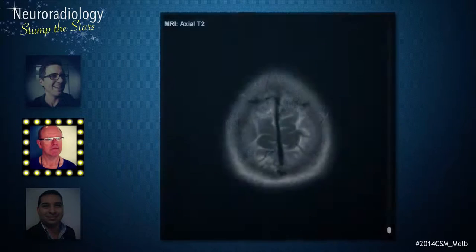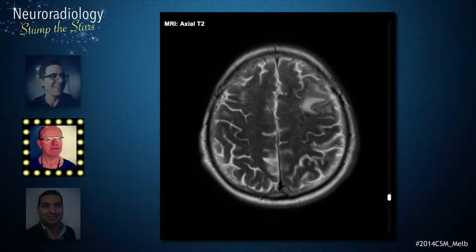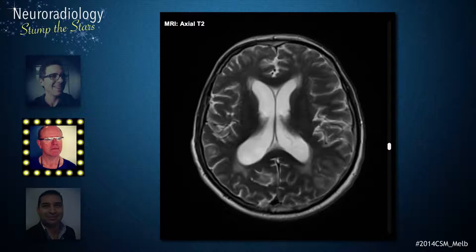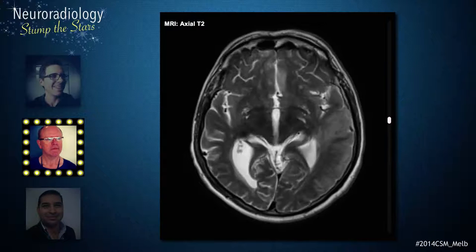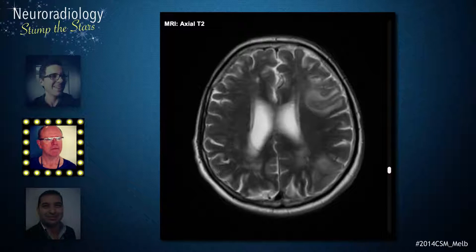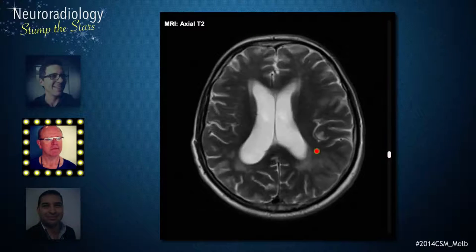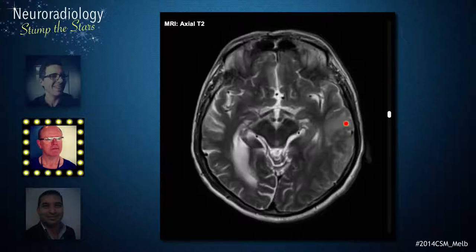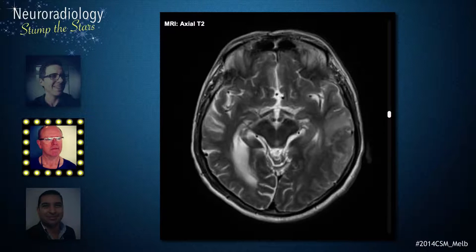The T2 axial scans demonstrate multifocal abnormalities throughout both cerebral hemispheres. The most striking abnormalities are in the left cerebral hemisphere, in the frontal lobe as well as parietal lobe, extending into the posterior temporal lobe. They consist of T2 signal abnormality in the white matter, extending into the overlying grey matter.